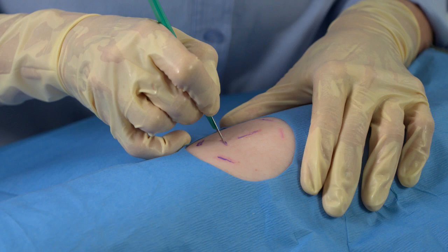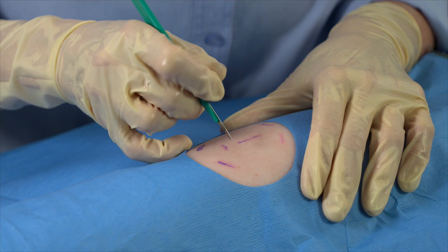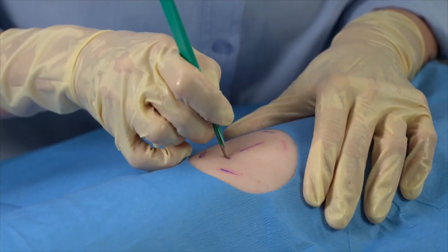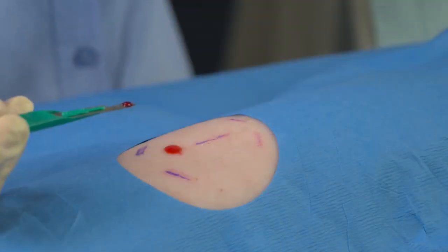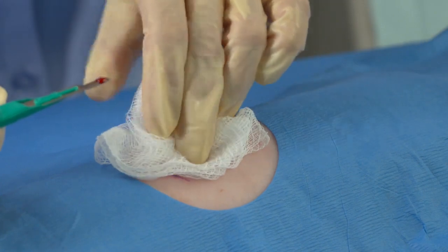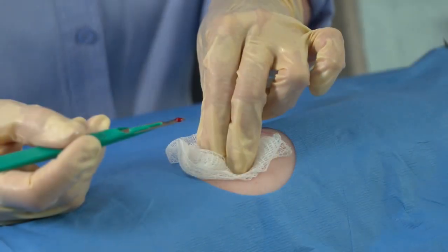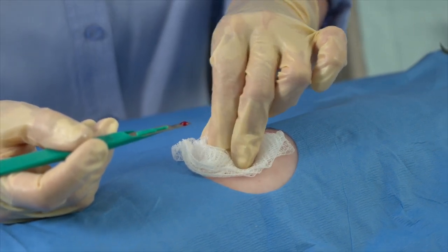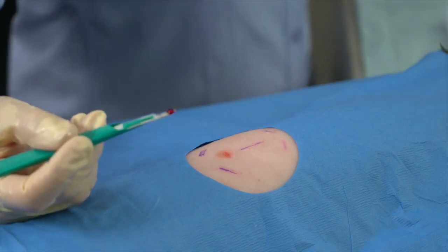Use the belly of the blade to make one clean 5 millimeter incision medially. Remove the blade from the incision, turn it 180 degrees, reinsert into the incision, and slightly advance it laterally. Turning the blade once ensures that the 5 millimeter incision is uniform from edge to edge. Place the scalpel back in the sterile field. Use sterile gauze and apply pressure to the incision site to control any bleeding.